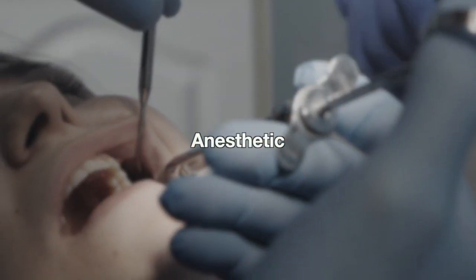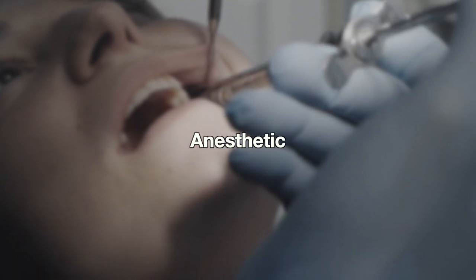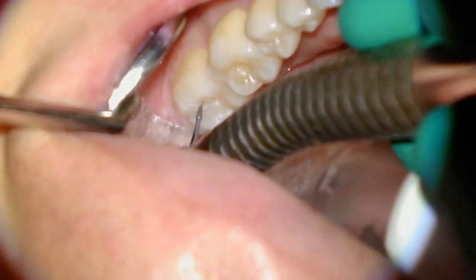Our recording doesn't really show us giving anesthetic to the patient because sometimes when we plan to use the Solea we don't have to give anesthetic, but you want to make sure you have that ready for your doctor in your setup.